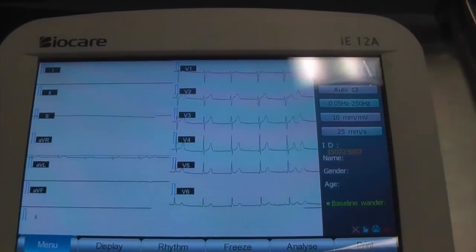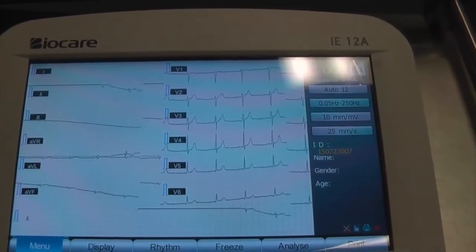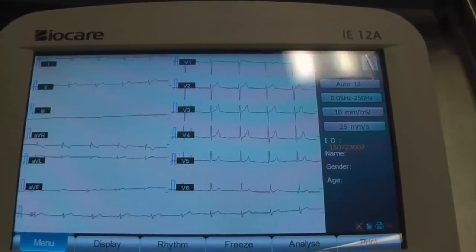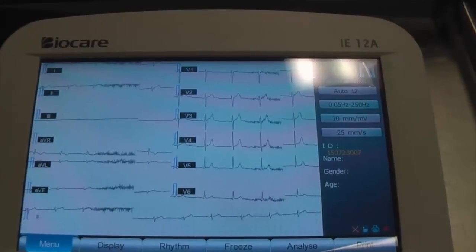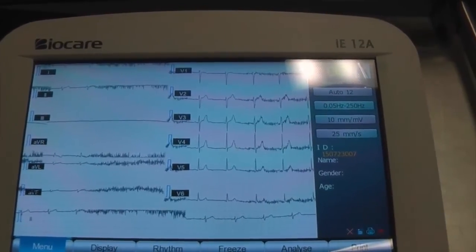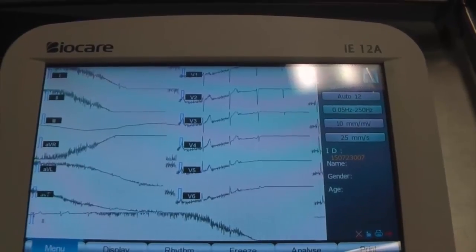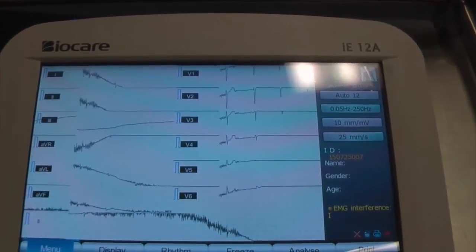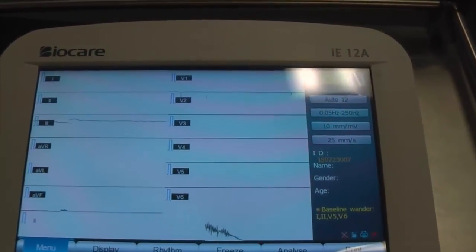We've got very poor leads on the left but it's actually pretty good on the rest. Can you just clench your fist? That's muscle artifact — where the patient is holding their hands or arms off the couch. If you relax again and now straighten out your legs, you can see the effect clearly.